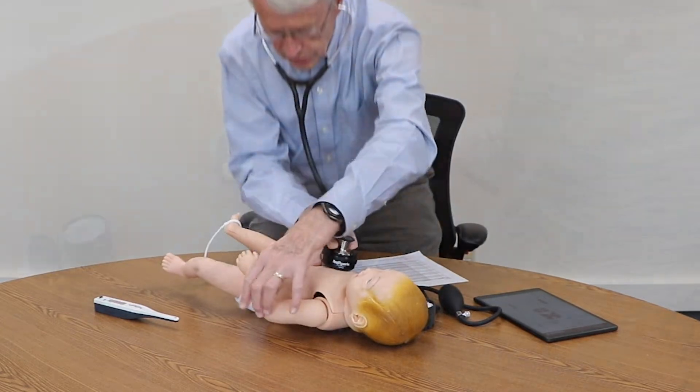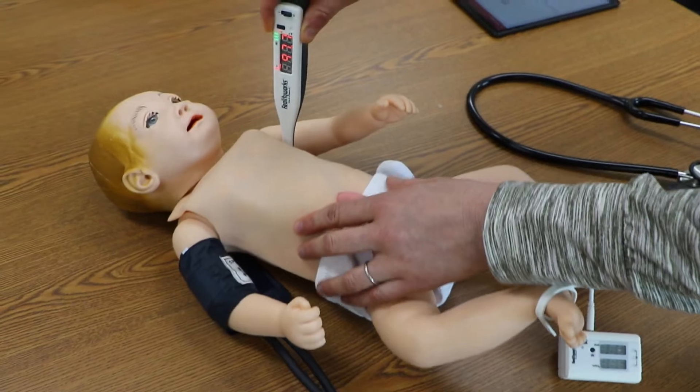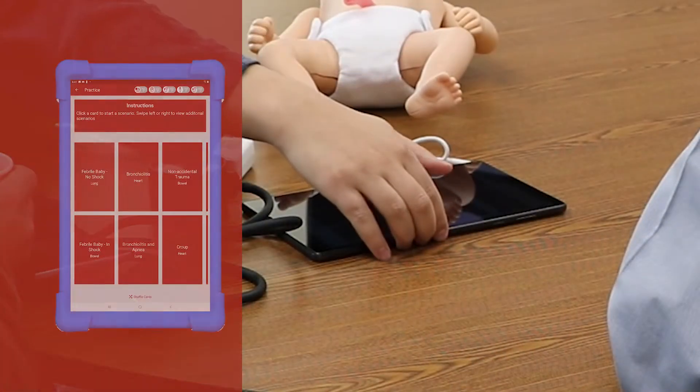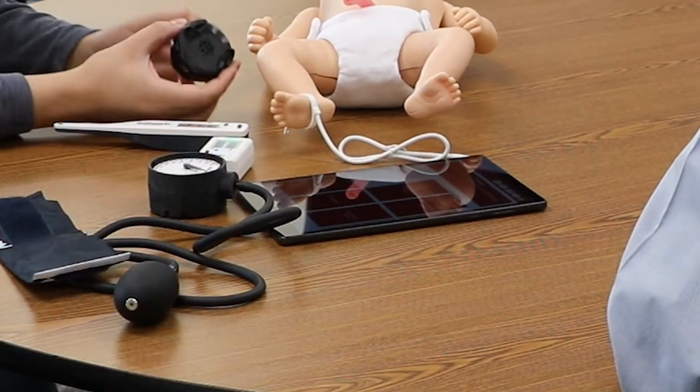This medium-fidelity trainer lets students practice measuring and documenting the vital signs associated with 15 common pediatric scenarios. Simply choose a scenario using the app, and the trainer will exhibit the vital signs associated with the selected scenario.